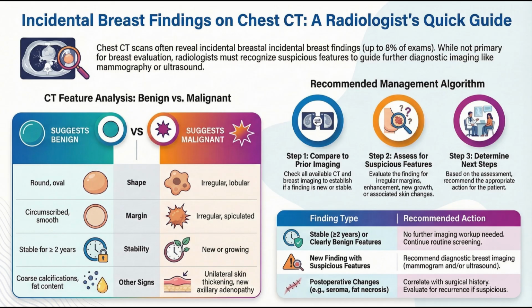It does. And what about reconstruction with a patient's own tissue, like a TRAM or DIEP flap from the abdomen? The baseline there should be mostly fat attenuation on CT, since that's what's moved. But a very common complication is fat necrosis. And how does that present? Initially, as some hazy, fuzzy-looking areas in the fat. Then, over about 6 to 12 months, you develop calcifications. It's benign, but we have to recognize it.